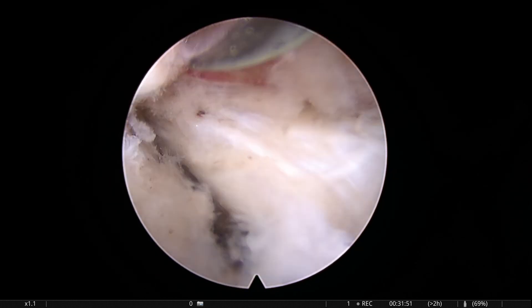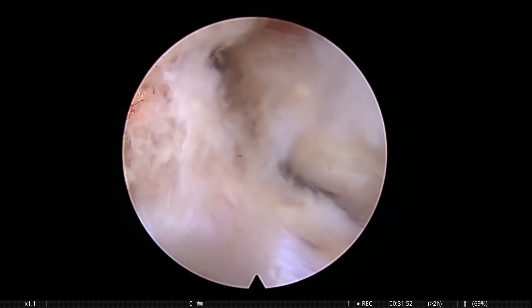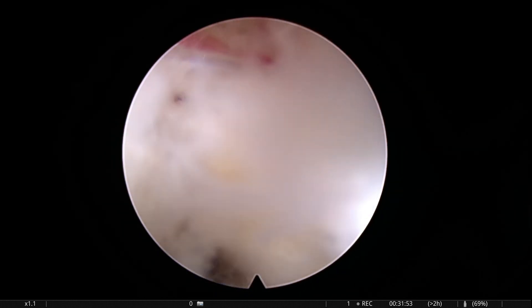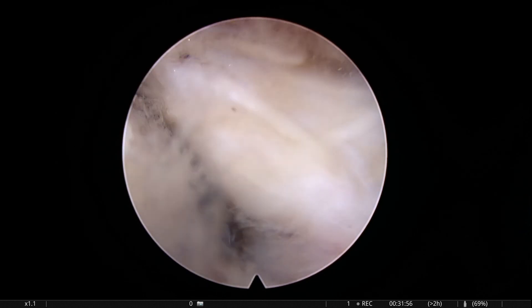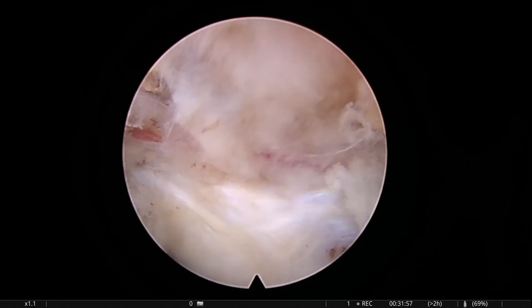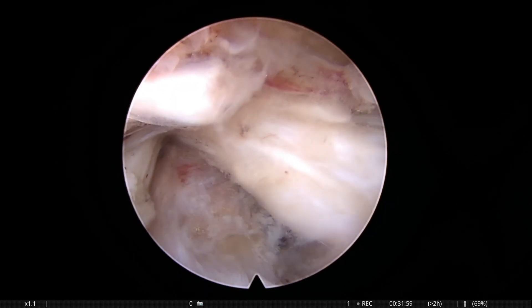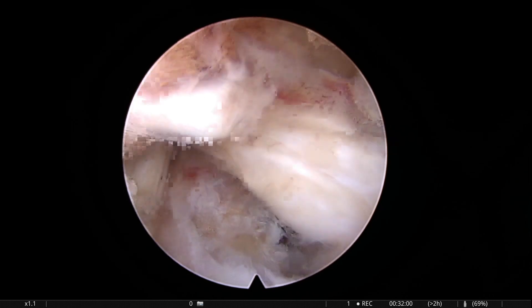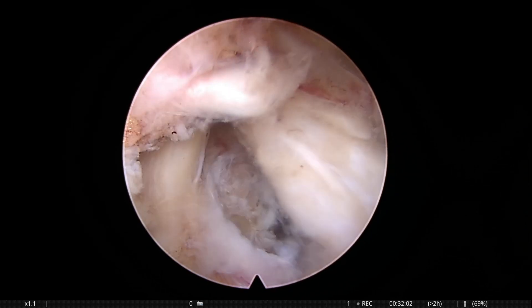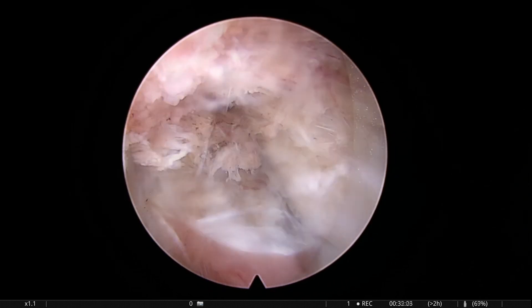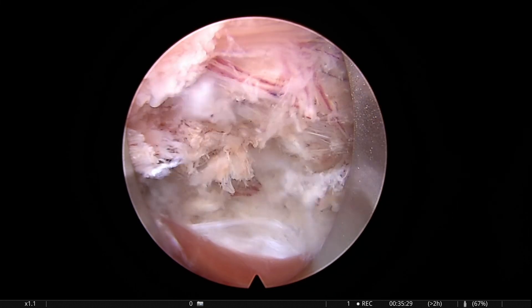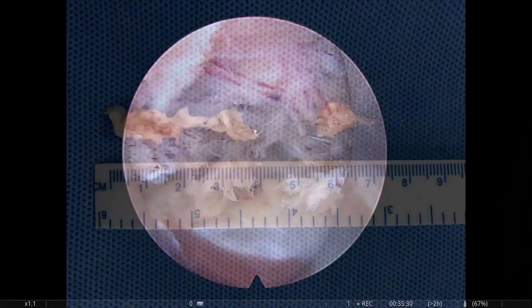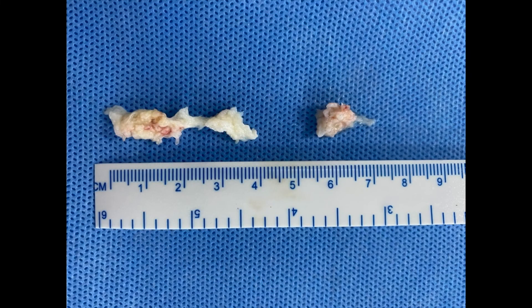Always remember you should not use excessive RF and be careful with the exiting root. Once this is confirmed, hemostasis is attained, cannula is removed, and you can see the removed fragment.